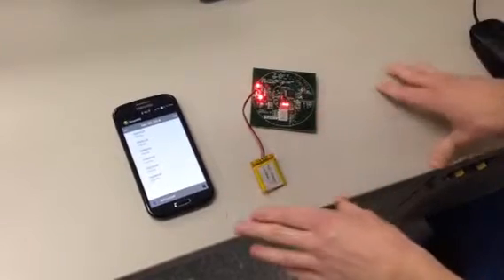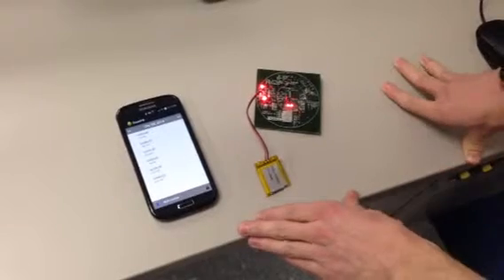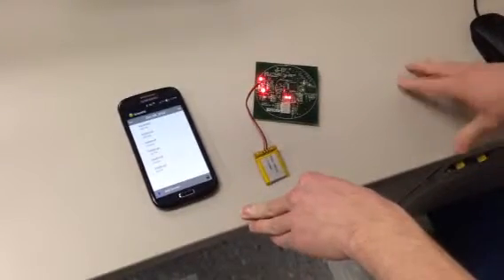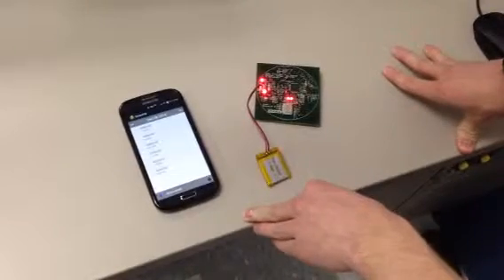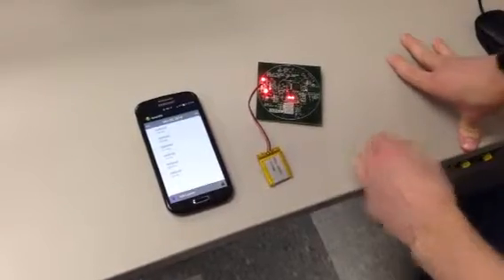Right now it's a bit bigger than a pill bottle, so we're going more with the concept in this demo. But essentially it's a way to make it transparent whenever patients take their meds, by alerting first their phone and then a server, so that their caregiver can track their adherence and they can track it themselves.